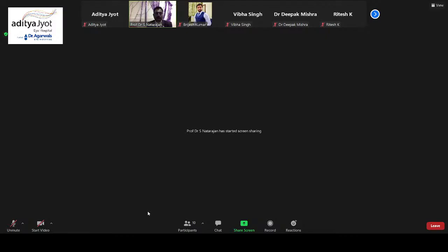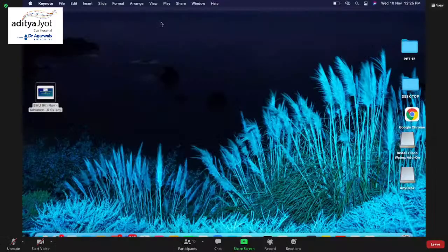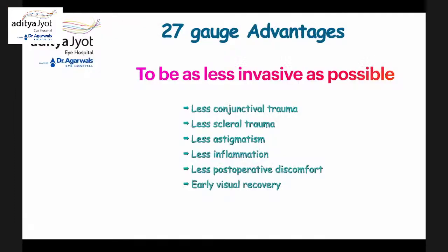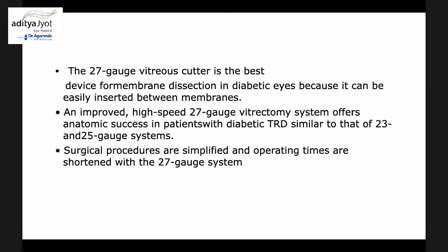You can see my screen, okay. So 27 gauge, so that there will be less inflammation, less postoperative discomfort, and early visual recovery. So 27 gauge vitreous cutter is the best device for membrane dissection in diabetic eyes because it can be easily inserted between membranes. Now with the proportional mode, you can even do it with 25 or 23 gauge.